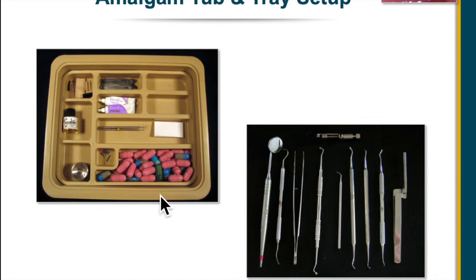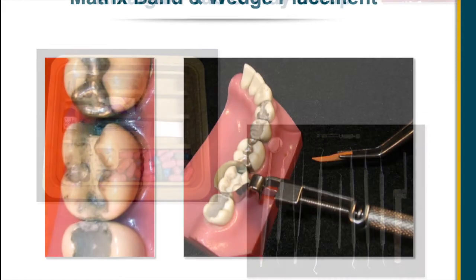An amalgam tub tray setup's pretty simple. There's not a lot to it. Amalgam fillings are pretty inexpensive and simple to place. That's why some dentists still use them today.